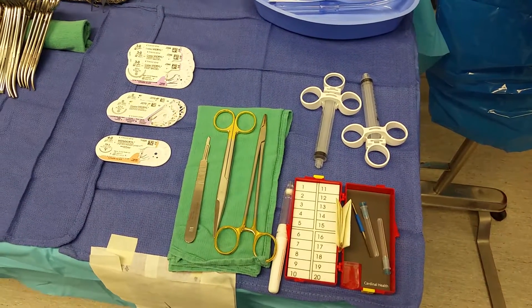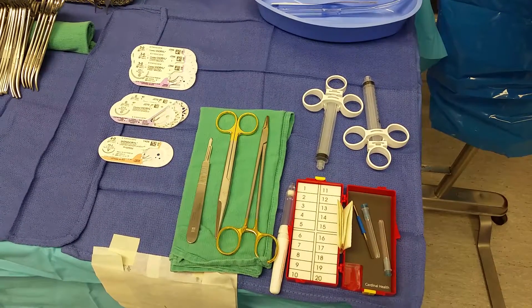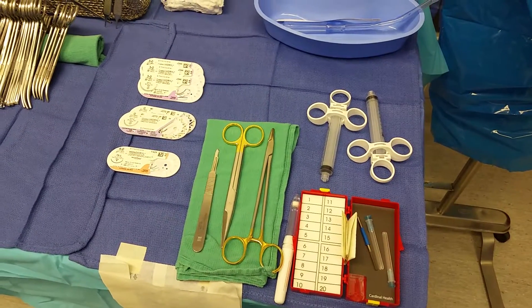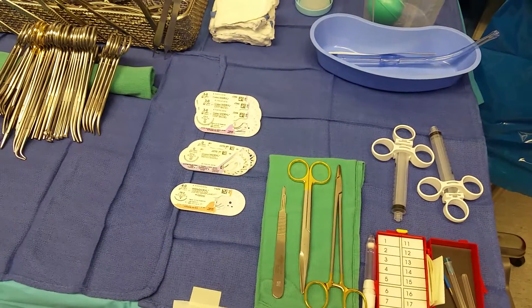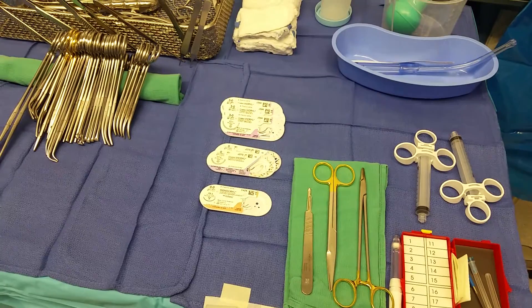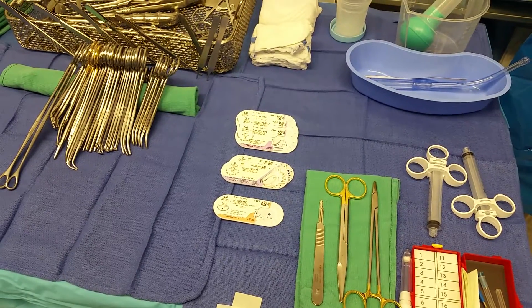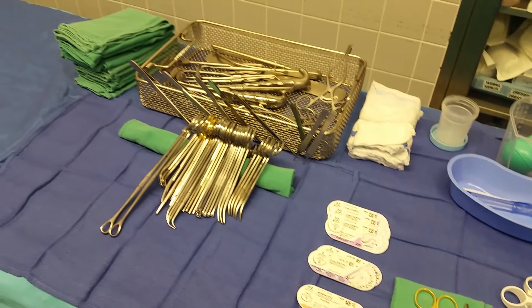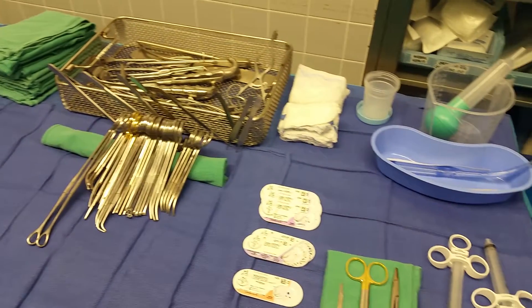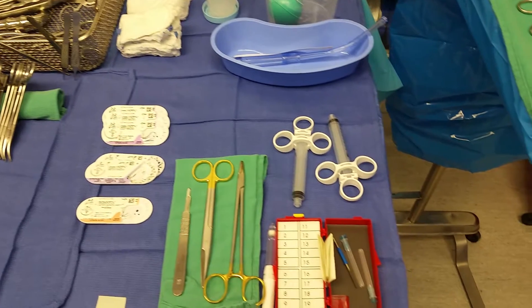because I want to make sure that I don't prick myself. I elevate it by using a towel, and I just expose all my needles so that I know what I have. If the surgeon wants to see what I have, he can fully see the table. That's pretty much how I do a standard setup for hernias.